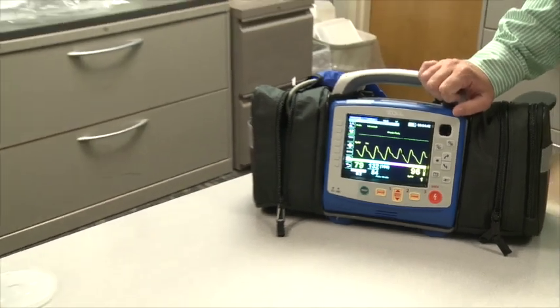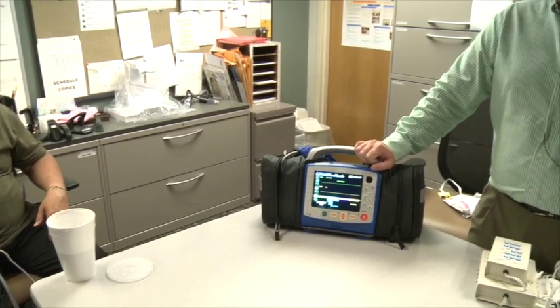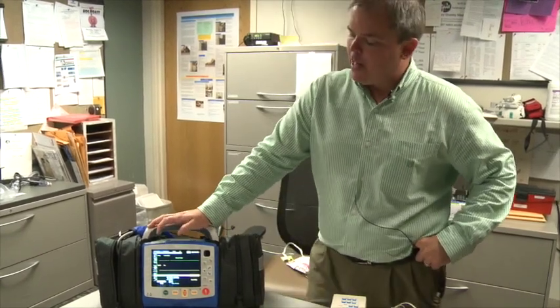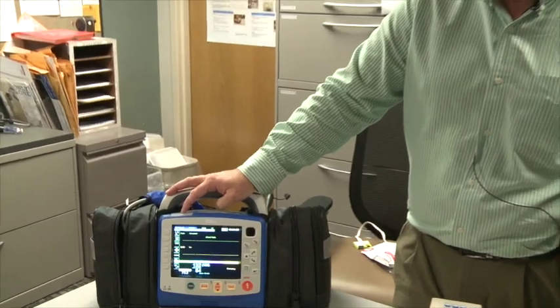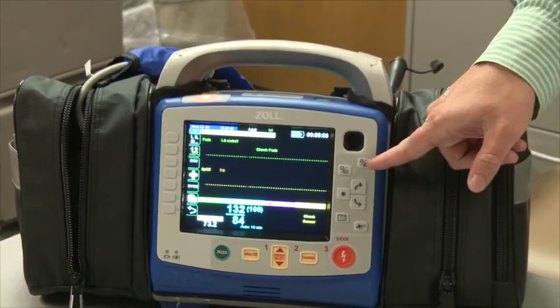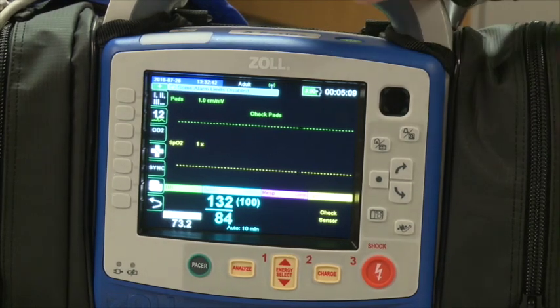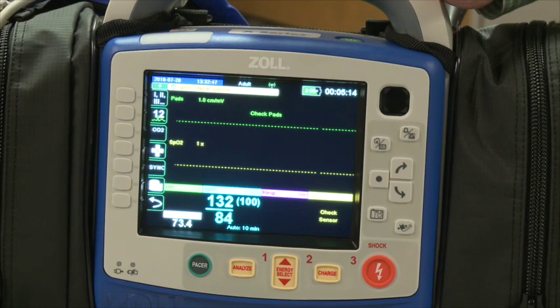Most alarms are turned off on the device. Two alarms we do not turn off are when an SpO2 probe falls off or an ECG lead pops off — we want to make sure you know those things are happening. A minor alarm, indicated by a yellow light, will activate after 15 seconds of the probe being off. The top key on the right-hand side is the alarm acknowledgement key. By pressing it, the alarm is cleared and it won't alert you again unless the probe comes off again.